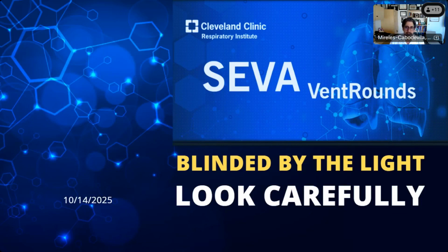So welcome everybody to SEVA VentRounds. Today is October 14, 2025, and we're gonna look at a couple of cases which we call blinded by the light. So I would ask you to look carefully. These are interesting in many different ways.